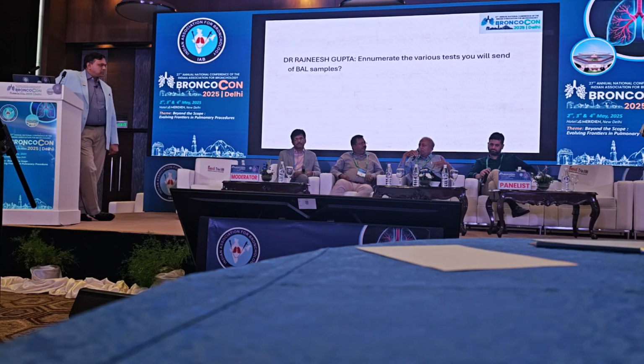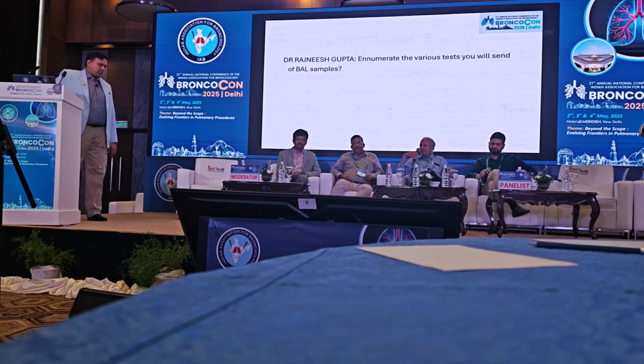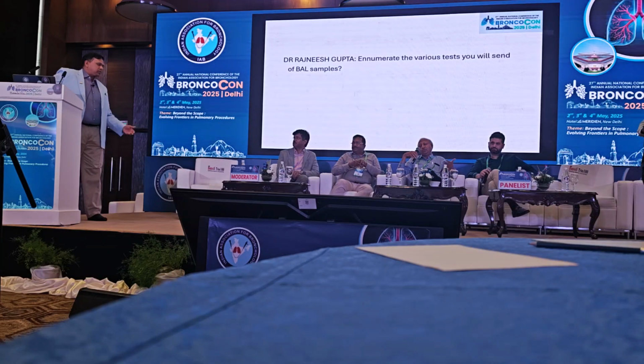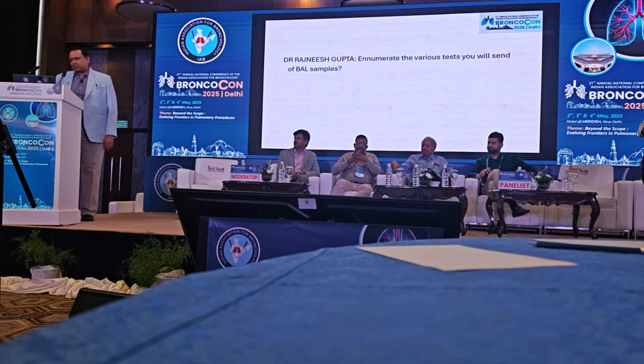Then automatically we go for LPA if it's positive, then viral tests for viral isolation. Rarely there may be a malignancy, so we look at cytology, for instance. Then other special tests can be there, if hemorrhage is suspected, we look for hemosiderin-laden macrophages, etc. Case-wise, this is for a TB patient. On clinical suspicion, we can take it. Definitely. Thank you so much.